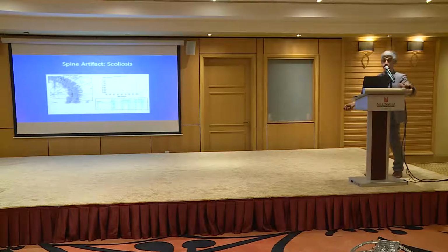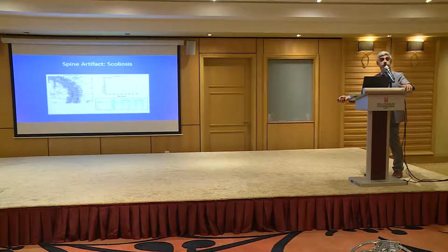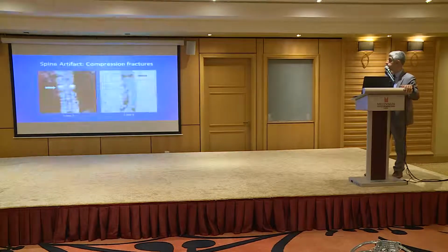This is scoliosis, and you have probably seen patients with a DEXA scan like that. These patients probably should not really look at their spine because it's completely abnormal. Okay? So you skip the spine in these patients and go for the hip and the forearm.